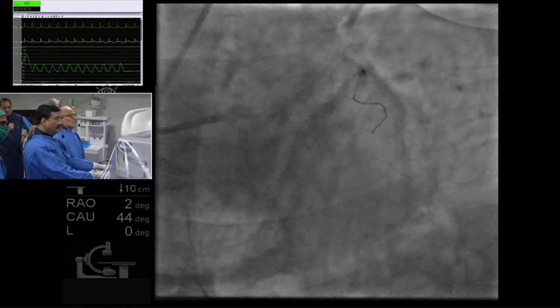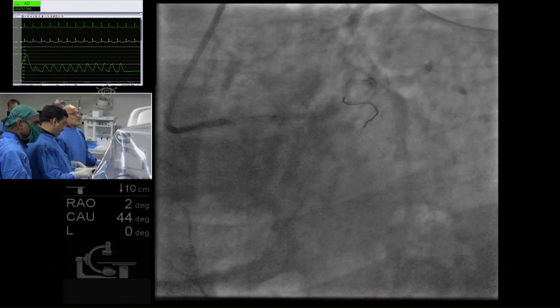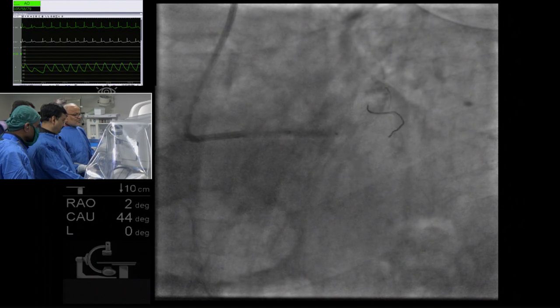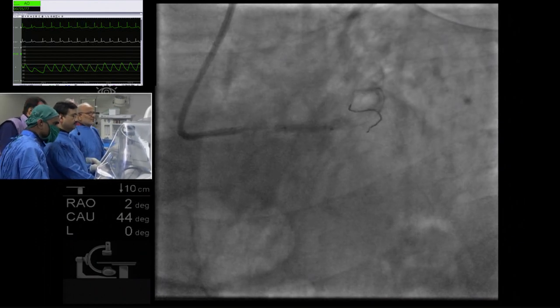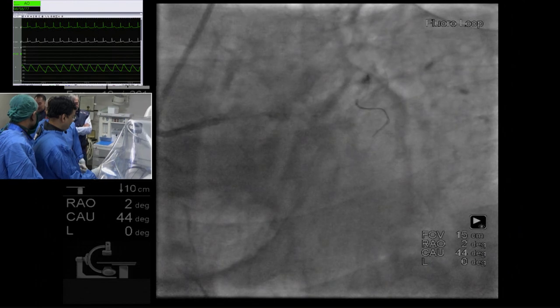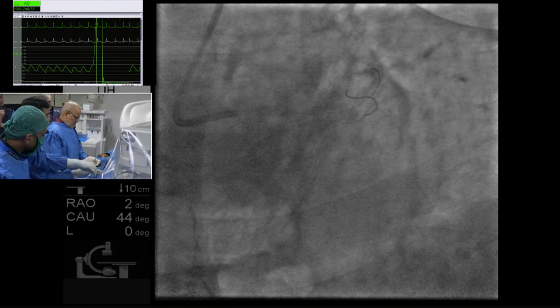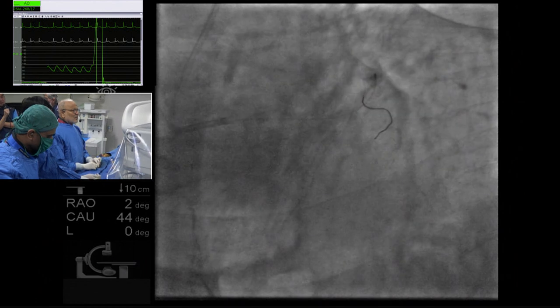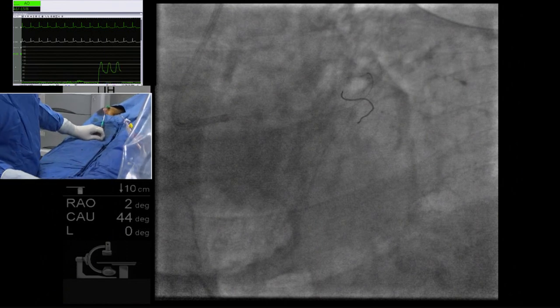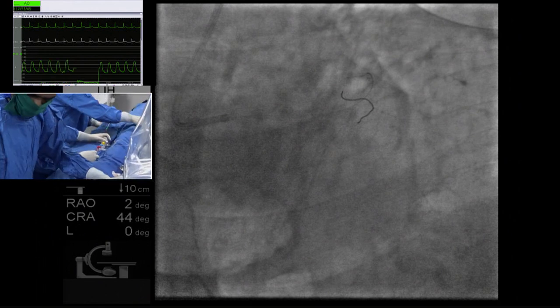Just talking about IVL, what we found, translating this technology to the structural world, is that we have used IVL in the iliacs to facilitate femoral access for TAVR. It's a very useful technology for the iliacs. So what size of balloon do you take for iliacs? We use a 5. I've seen 5 or 6. We have 7. Because you need a minimum diameter of 5.5. Now they make an 8, maximum. But 7 works well, depending on the size of the vessel. You crack the calcium, and that allows the TAVR device to go. That's much better than doing alternative access.